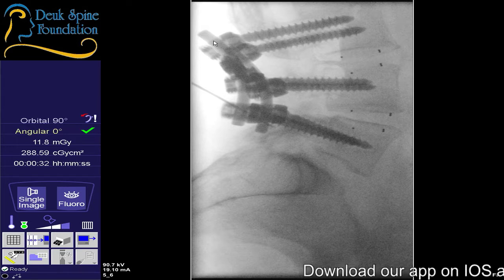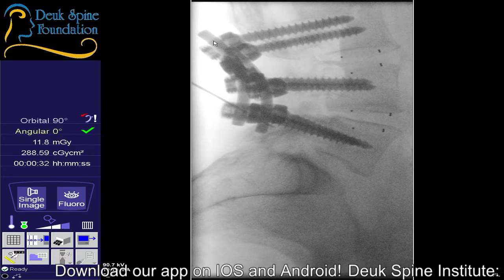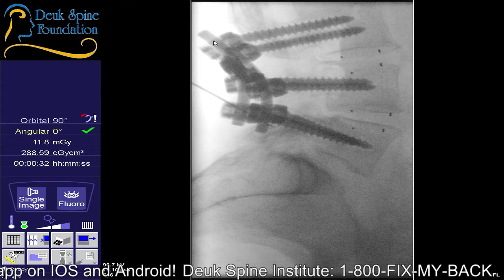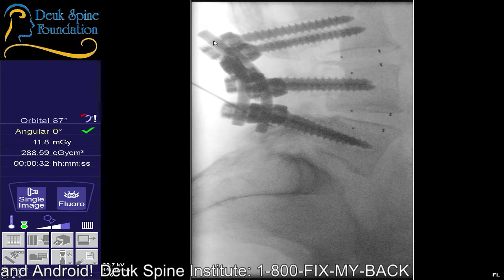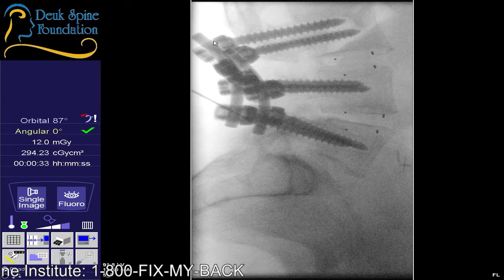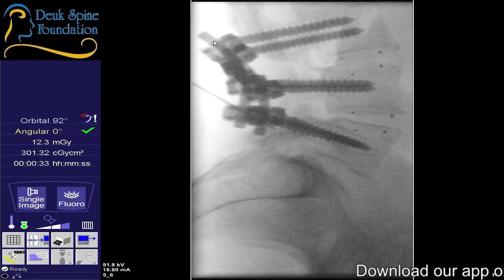I wonder if we need to... I think there's a little bit of that going on, planing. Let's try lifting your side a little bit, just like 3 degrees, and get a shot. It definitely changed it, but did it make it worse? I think it made it worse the other way. Yeah, go 6 degrees. That's better. That's definitely better. But I'm still not seeing the end plate at 5-1 that well. But all the other bones are lining up pretty good. So we must not be very far off.